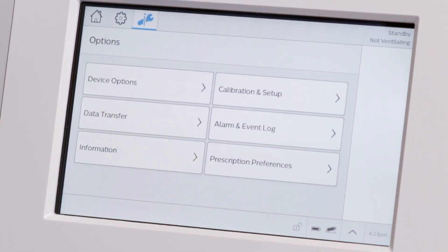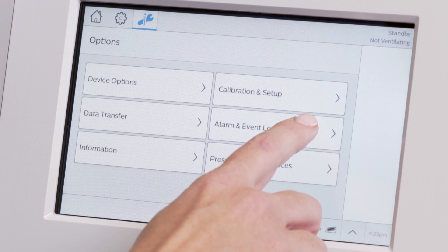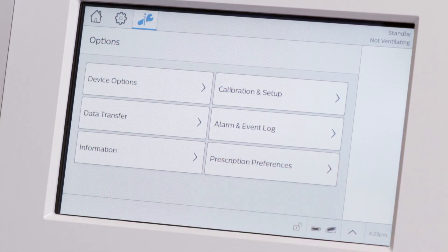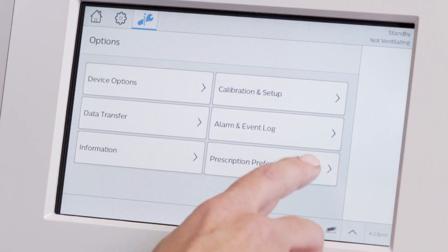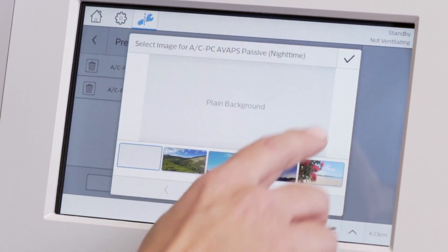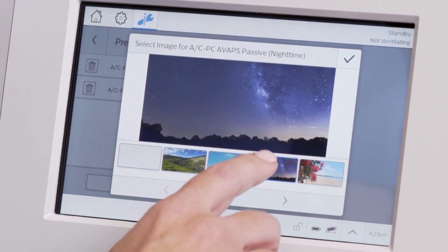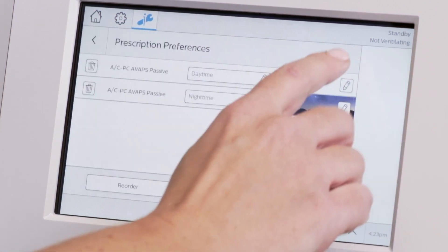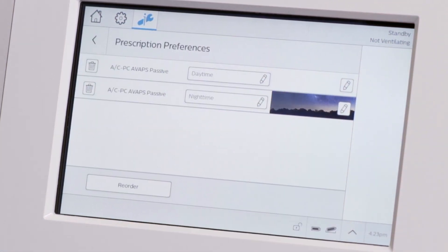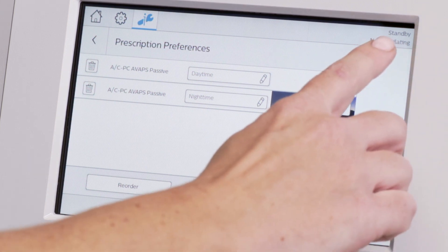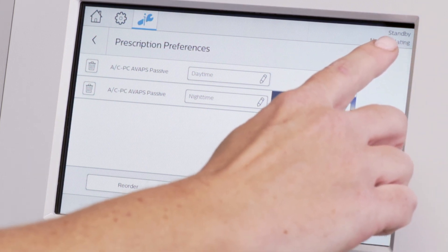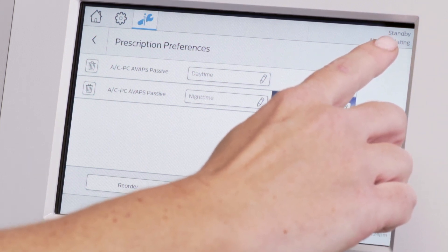Calibration Setup contains O2 and CO2 sensor calibrations, among others. Below that option is Alarm and Event Log. In Prescription Preferences, you can delete or edit the prescription names and background images. In the top right corner, you can see the current prescription being used or, in this case, standby.